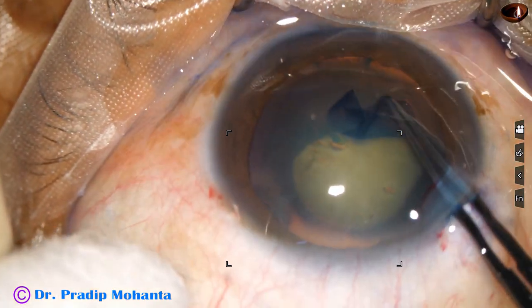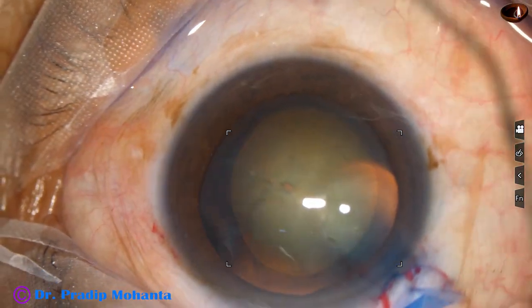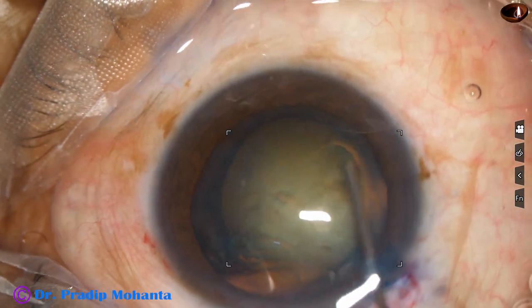Capsulorhexis is done with a utrata forceps. A capsular tag is raised and guided anti-clockwise to get an adequate size rhexis of about 5.5 millimeters. Now hydrodissection is done.